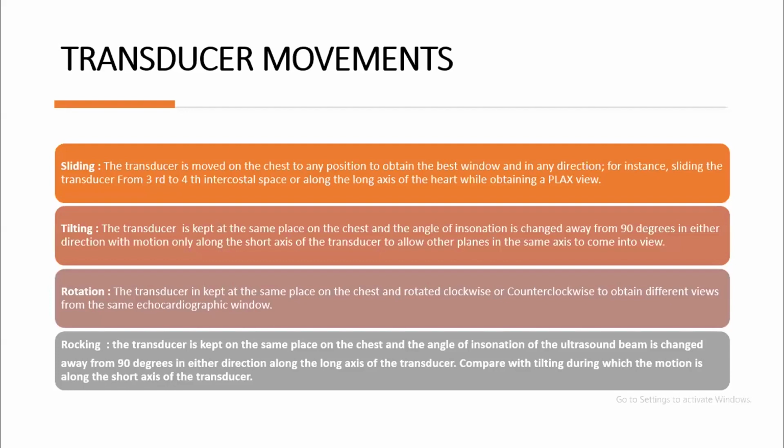Rotation, the transducer is kept at the same place also on the chest and rotated clockwise or anti-clockwise to obtain a different view from the same echocardiography window.